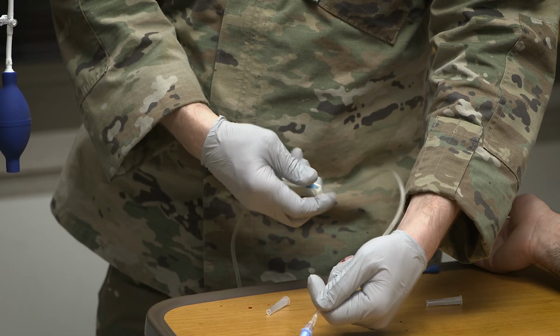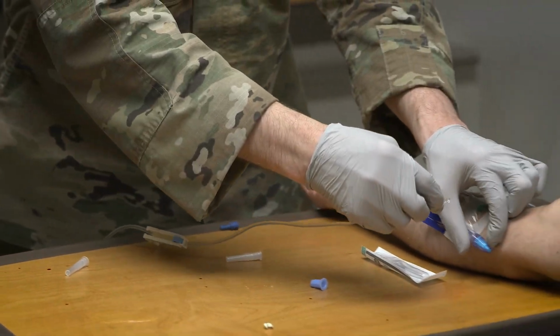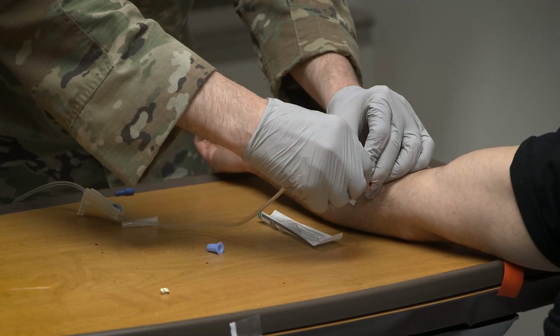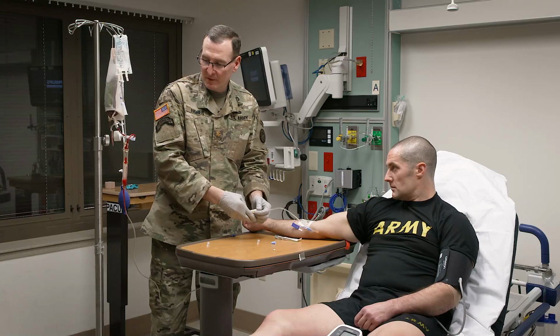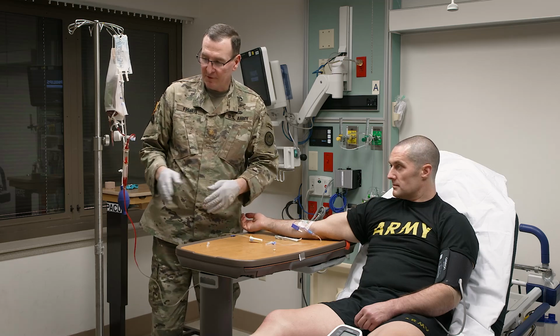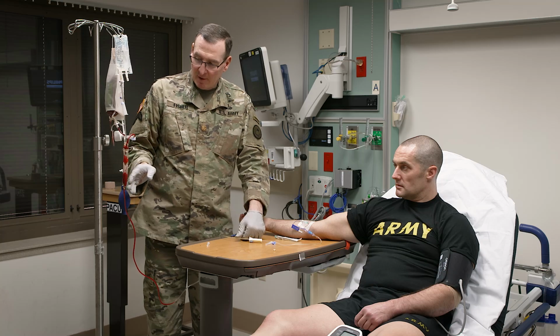All right, so now I can go ahead and hook it up to my patient. Go ahead and start running. You can see the blood in here. You can go ahead and prime it a little bit more if you want to.